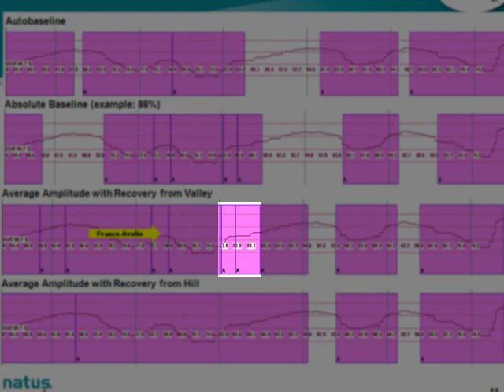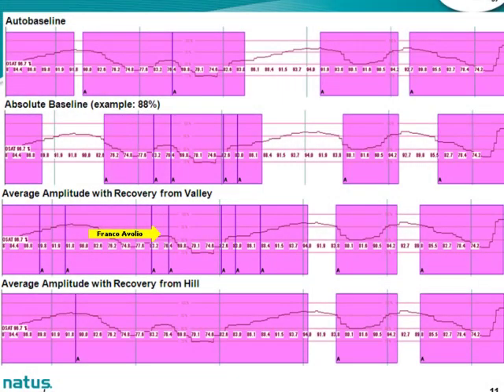If you recall earlier when I talked about the respiratory analyzers, the system will compute an average amplitude. And the amplitude, again, is not a moving window. So it's not as simple as just looking at the previous 10 seconds or 20 seconds of data. The analyzer is a little more complicated than that because it's trying to account for drops, for old baselines, new baselines. And so just because it says average amplitude, it doesn't mean that it's looking only at the previous 10 seconds or 20 seconds.